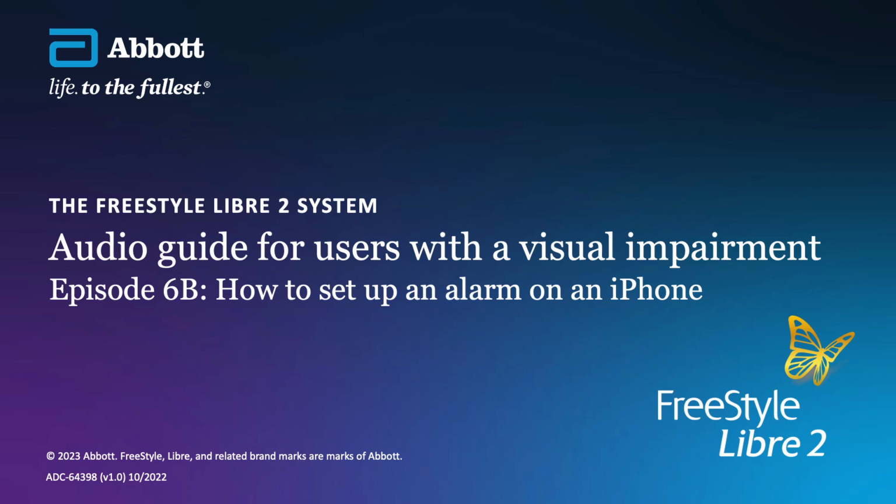Access the alarm screen through the main menu. This is the third option down. When you first open the alarm screen, there will be a Learn How section, and the app will prompt you to allow critical alerts. On the alarm screen, you'll find 3 alarm options. From the top down, these are low glucose alarm, high glucose alarm, and signal loss alarm. All alarms are switched off by default.